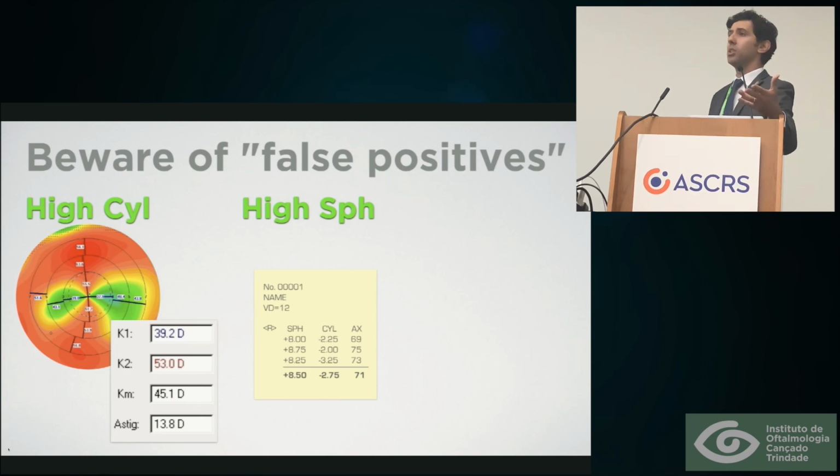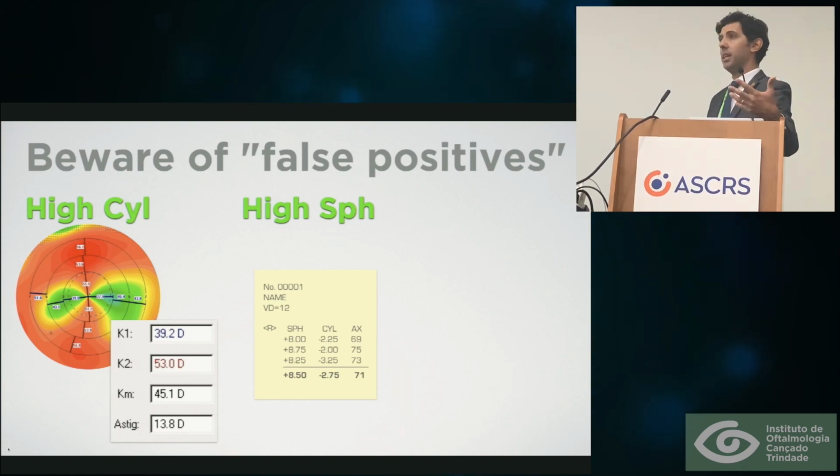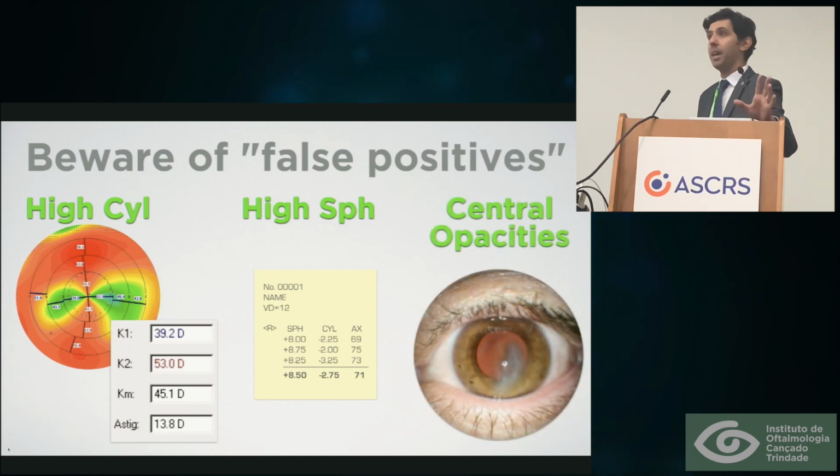And when we do a pinhole occlusion in this patient, we might think that this is the best case. No, the pinhole will not be able to neutralize this high hyperopia and give this patient a good visual rehabilitation. We need to approach this hyperopia even together or before, be it with an IOL exchange or some other sort of correction, to then apply the pinhole successfully. So be aware of those cases where you get a good pinhole acuity test, but present with this high hyperopia.